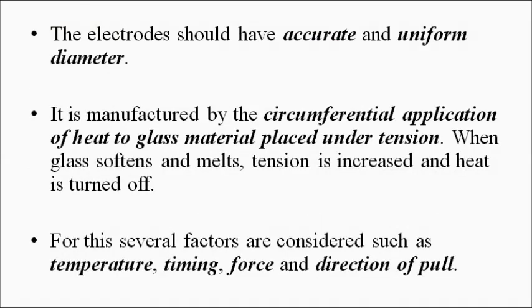Okay, so these microelectrodes, the glass microelectrodes, have accurate and uniform diameter because they are used for very minute, very detailed measurement, and any slight deviation from the required dimensions, the required specifications, will result in failure in the measurement of the signal.